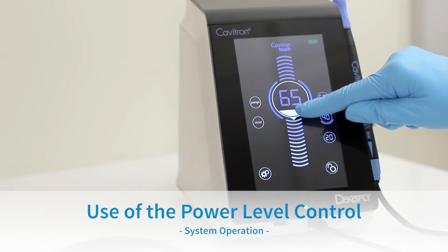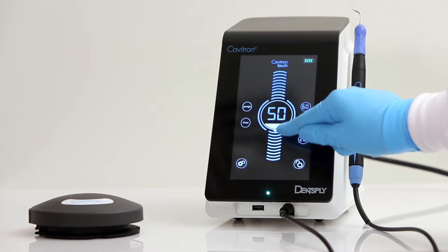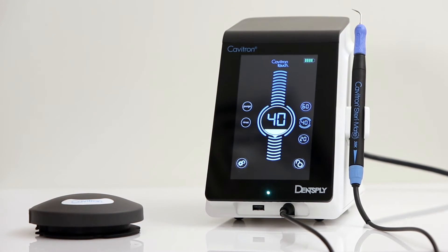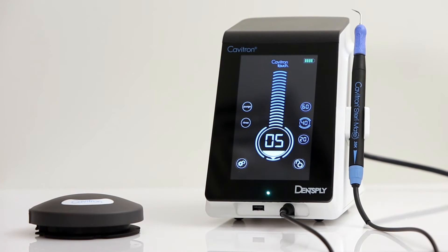Use of the Ultrasonic Power Level Control. To control the ultrasonic power level, simply slide to select your desired power level. Sliding up increases the distance the insert tip moves, while sliding down decreases the distance. A power level may also be selected by pressing the desired position on the power scale. The power range indicator fluctuates from 5% to 100%. Please note that there is not a visible blue zone; 5% to 35% is considered the blue zone range.